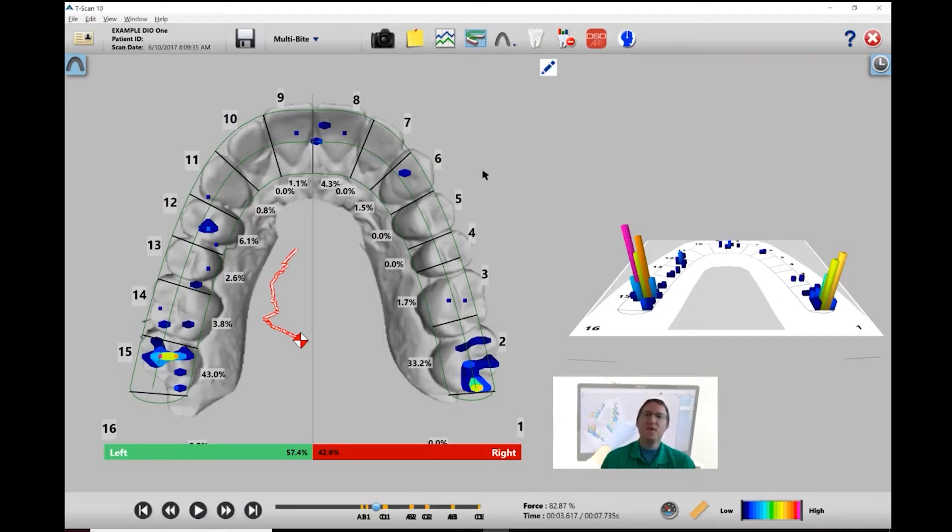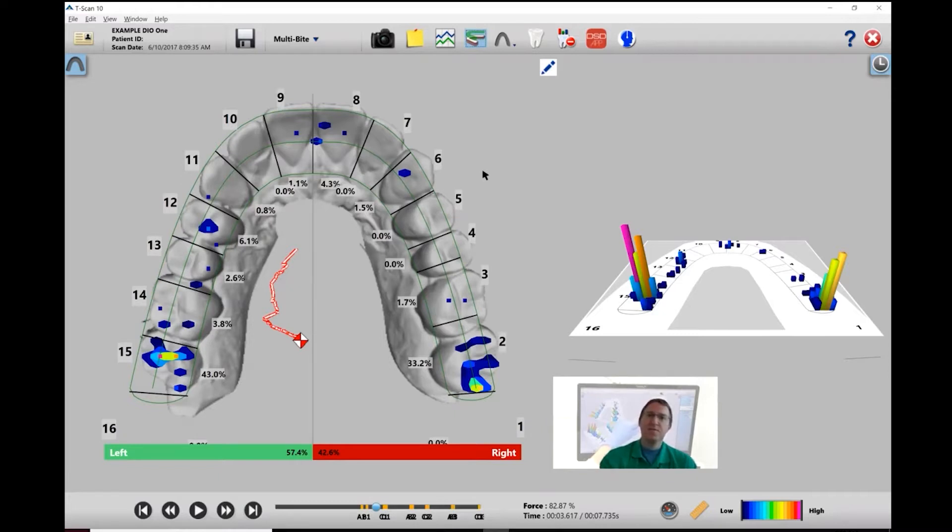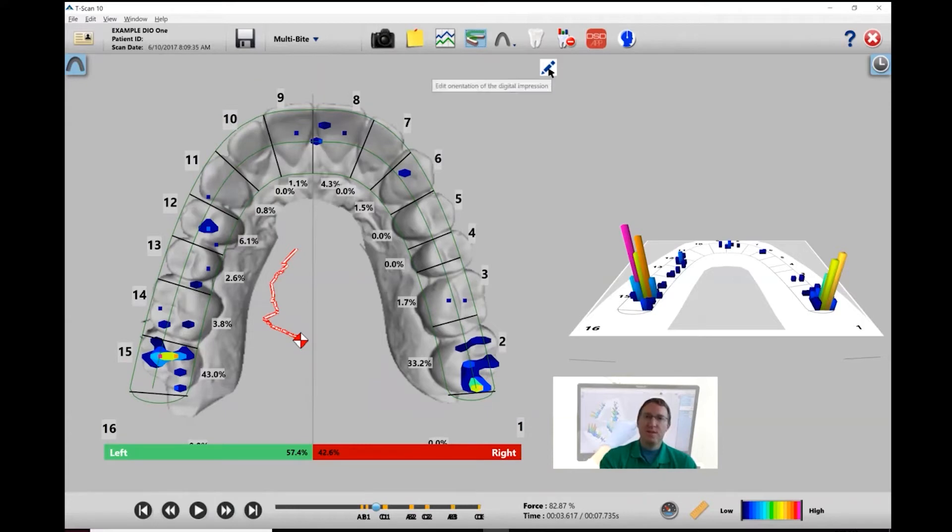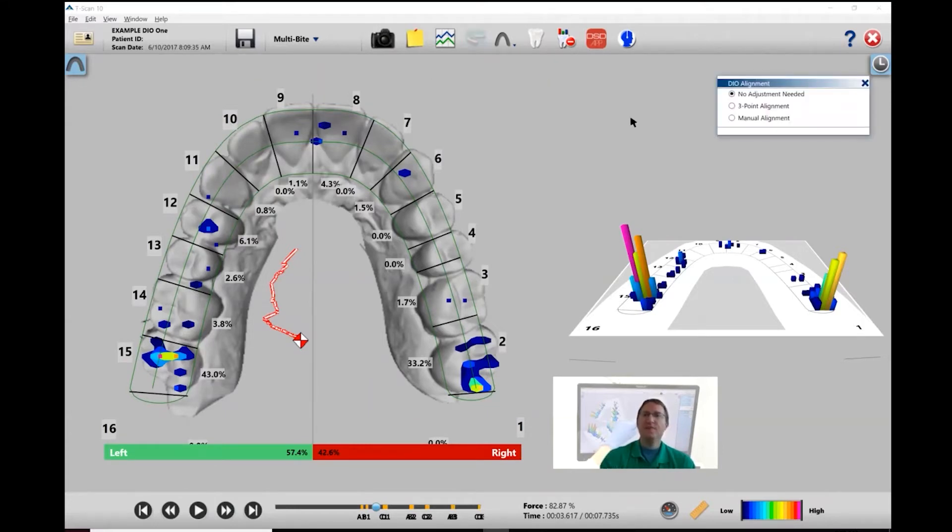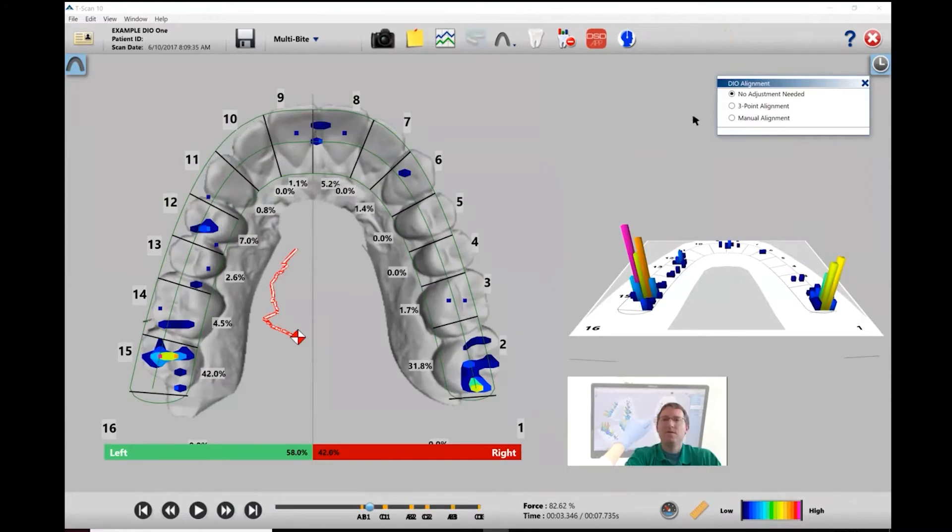At this point, you want to verify that the forced contacts and locations match up with what you see on the patient. If you need to make any changes, just go up to this tab, left-click, and T-Scan gives you two options to align the digital impression.